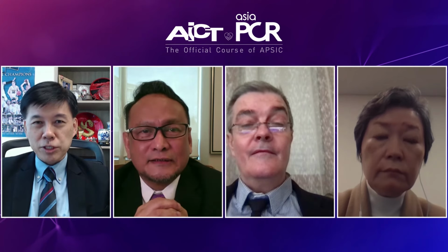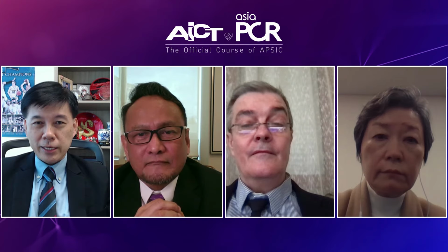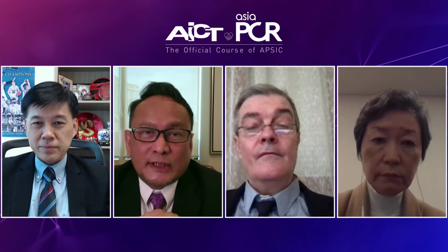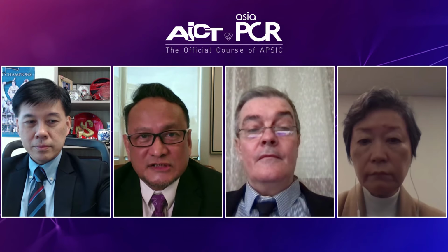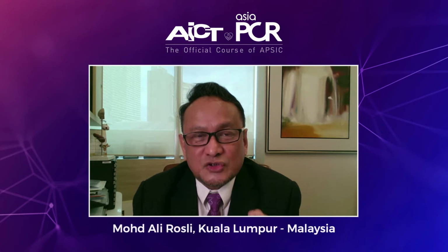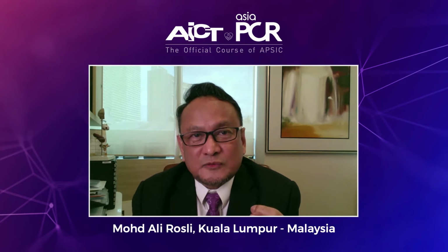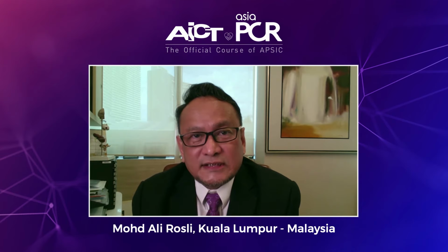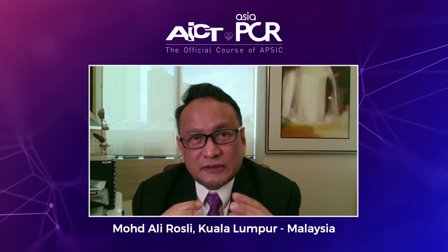The audience is asking, what are the problems dealing with aneurysmal lesions, like this case here, in the PCI setting? Well, of course, number one is that you're concerned about being able to wire successfully, and sometimes it can cause dissection. Obviously, the choice of wire is also very important. One may want a more stable wire, so you pick up a stiffer wire, and a stiffer wire can cause perforation. And last but not least, in terms of results, what is important is to try to ensure that you get good results.